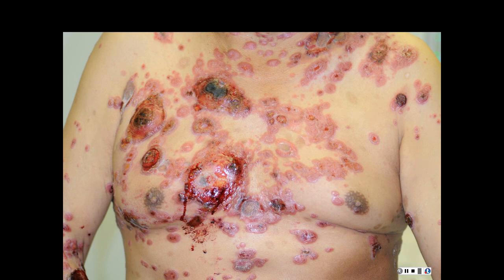Lymphoma is probably your top four. And then after that, you'd have to think of infectious things, possibly vasculitic, less likely. These are really beautifully circular. So probably something infiltrative neoplastic and probably lymphoma spectrum. And then do you think this is more likely a cytotoxic or a non-cytotoxic lymphoma?